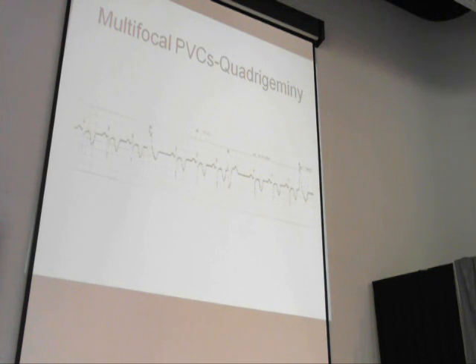But we get concerned about PVCs when they follow a pattern. Like a patient hooked up to the monitor who has more than 6 a minute. More than 6 PVCs in a minute, I'm going to get a little antsy and think, okay, what drugs do I need to get now? If their PVCs are multifocal, meaning I've got 2 different looking ones on my screen that I can put my finger on, I'm going to be more concerned and think, okay, I'm going to treat that PVC.